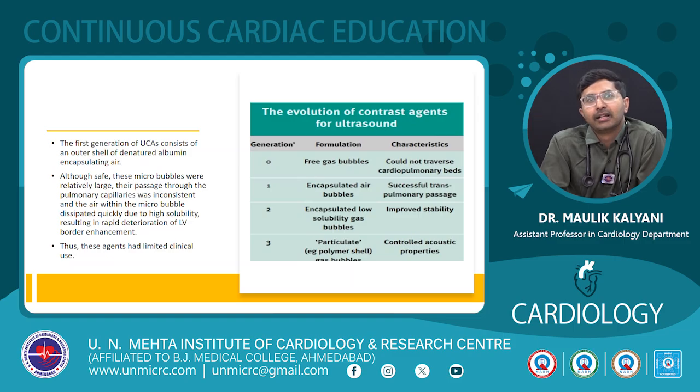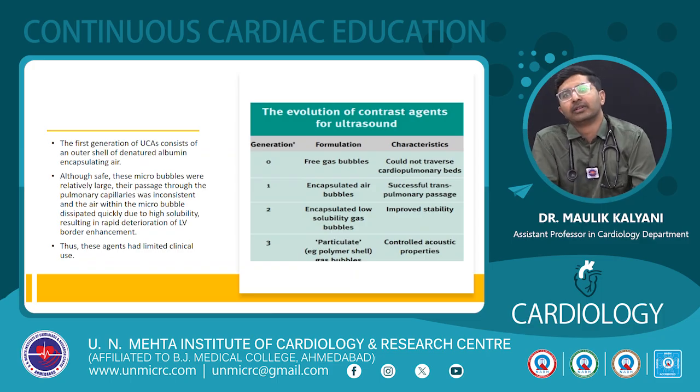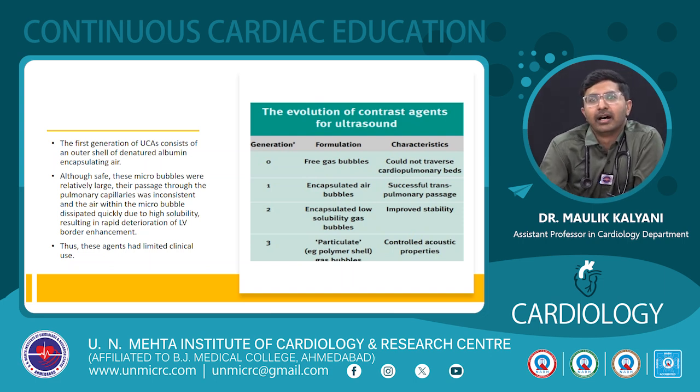So these are the old generations of how ultrasound contrasts evolved. The first was only inert free gas bubbles, which could not traverse the capillary beds. Then we have those encapsulated with albumin and other macromolecules, so they can traverse, but the stability was not good. In the next generation, the stability was improved, and in the latest third generation, the acoustic properties are also linear and controlled.